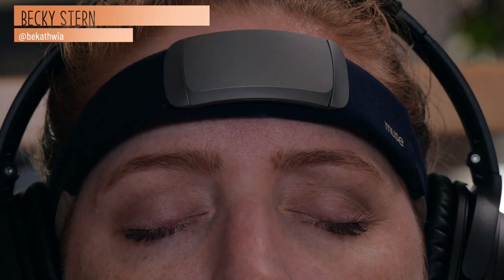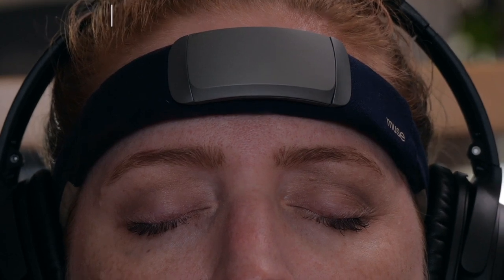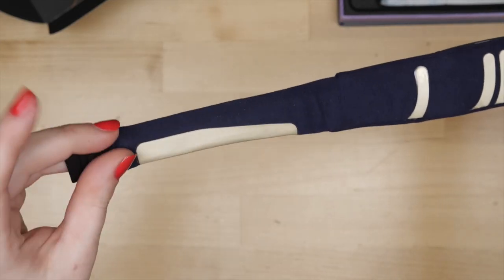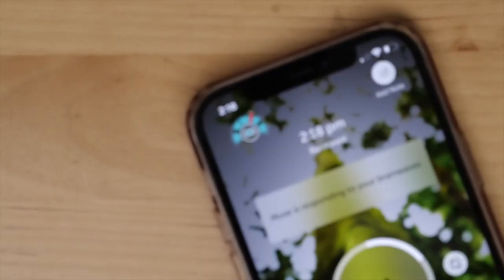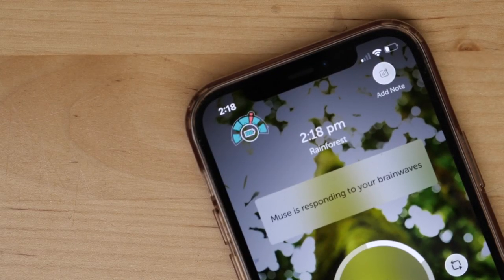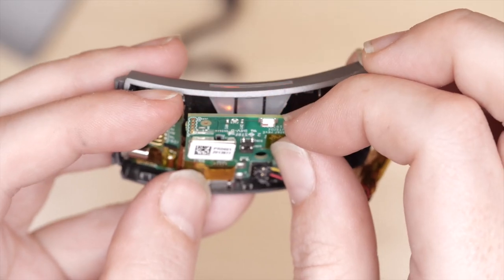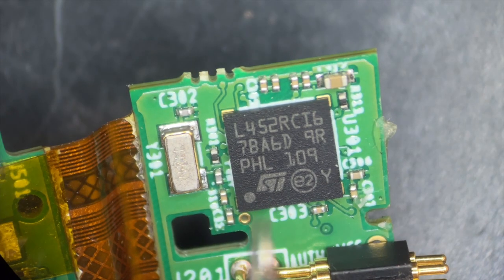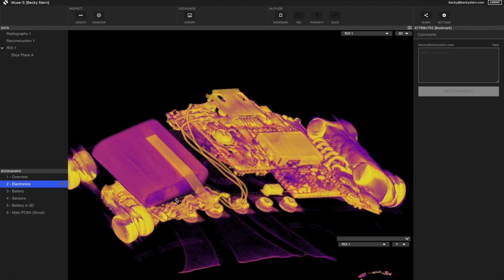Hey, it's Becky. Today I'm taking a look inside the Muse S Meditation Headband. This brainwave sensing device uses conductive fabric sensors to track your brain activity, and that biometric data informs the app's meditation and sleep programs. Keep watching to see me try it out, take it apart, and analyze the design and manufacturing of the circuitry inside.